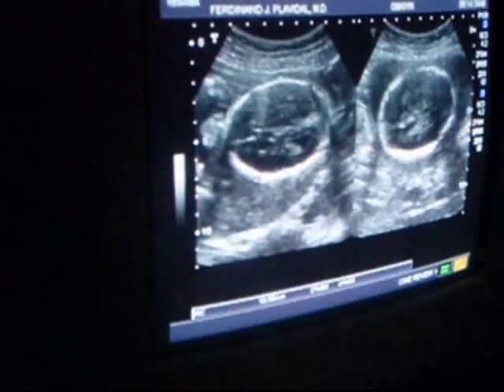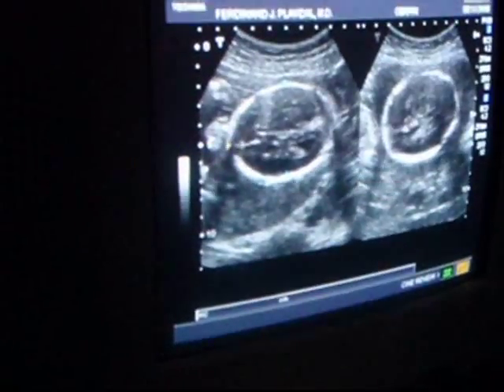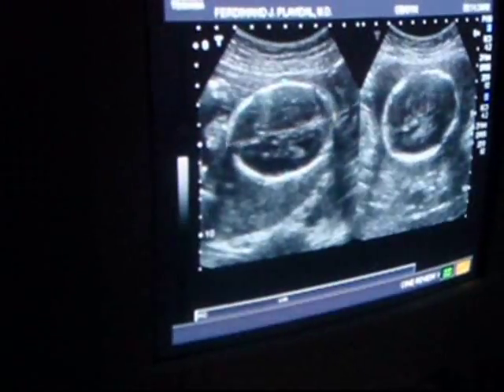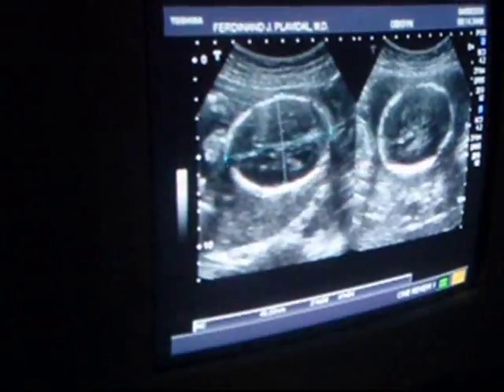Hang on, I'm talking to the machine and to myself. And here's the forehead. The back of the head about right there. And just going to trace that outline.